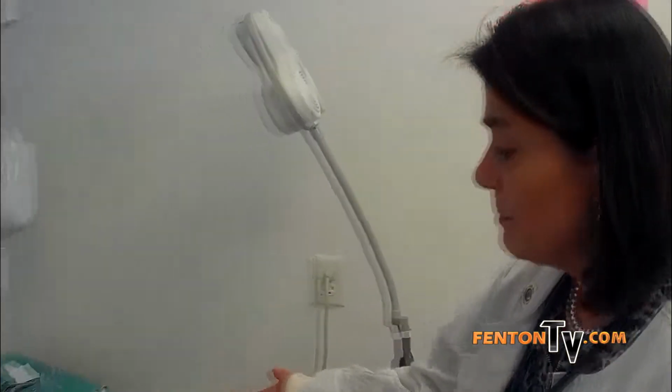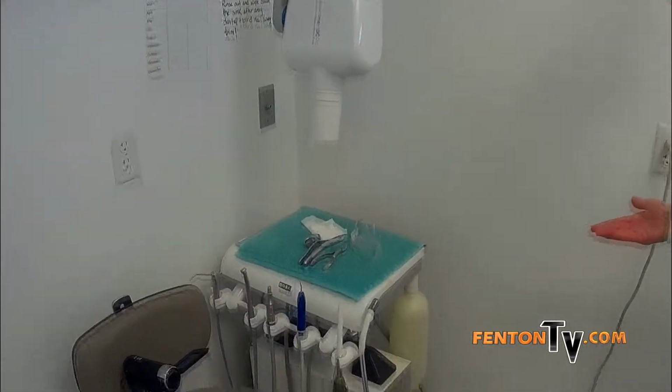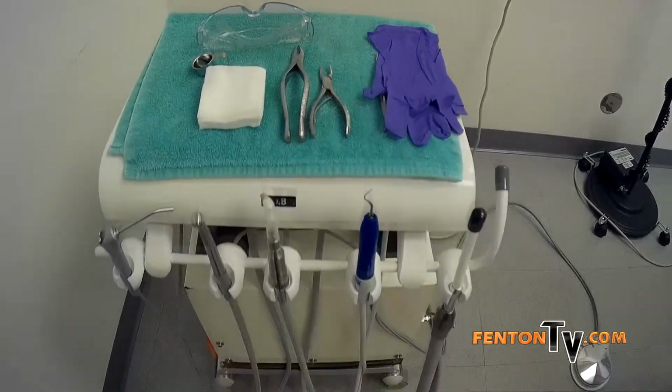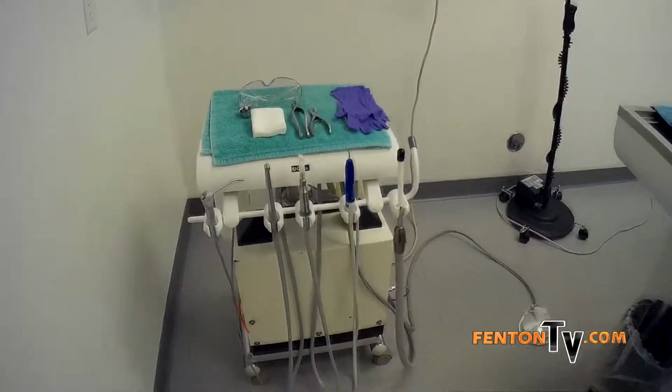We have over here a high-speed drill and an ultrasonic scaler and polisher. So what we do with these instruments is we scale off the calculus on the teeth. We do supra and sub, so above and below the gum line. Then we polish. If we don't polish, the teeth are actually more rough than we start, and it accelerates the rate at which dental calculus develops.